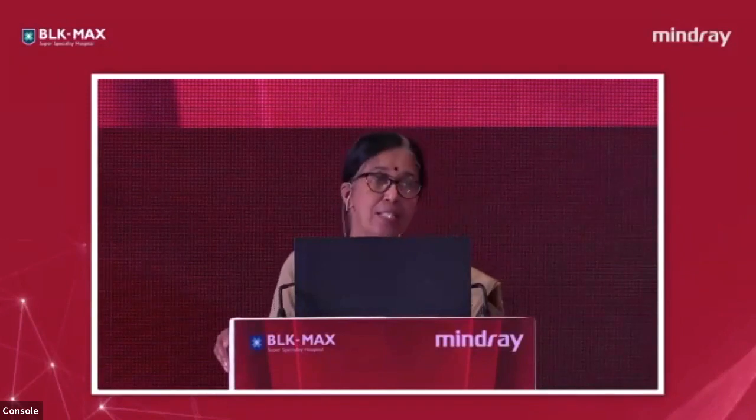So this can contribute to erroneous results that we produce by the analyzer. Yes. Thank you. Just as a proposal from me, when you realize that you are going to receive samples from a center, I recommend emulating the transport: send a sample collected in your own lab, sending it for half of the time that you need to arrive at this place and return to your lab, and measure again.